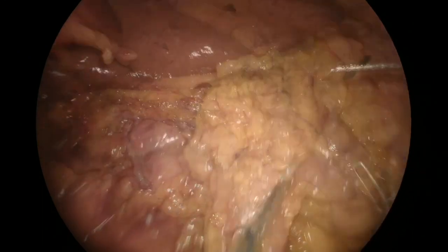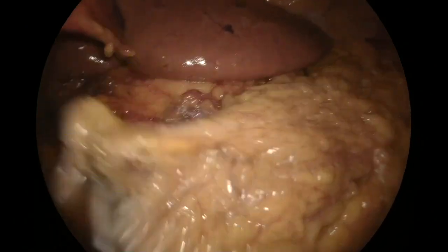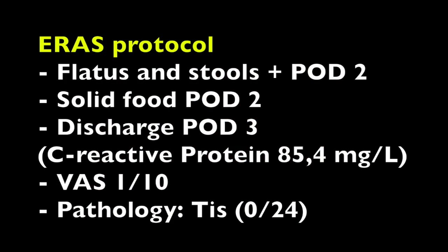Here we can appreciate the final result with no traction and no twist of the mesentery. Postoperative course was uneventful. The patient left the hospital on POD3; pathology showed a pT3 adenocarcinoma with 24 lymph nodes harvested.